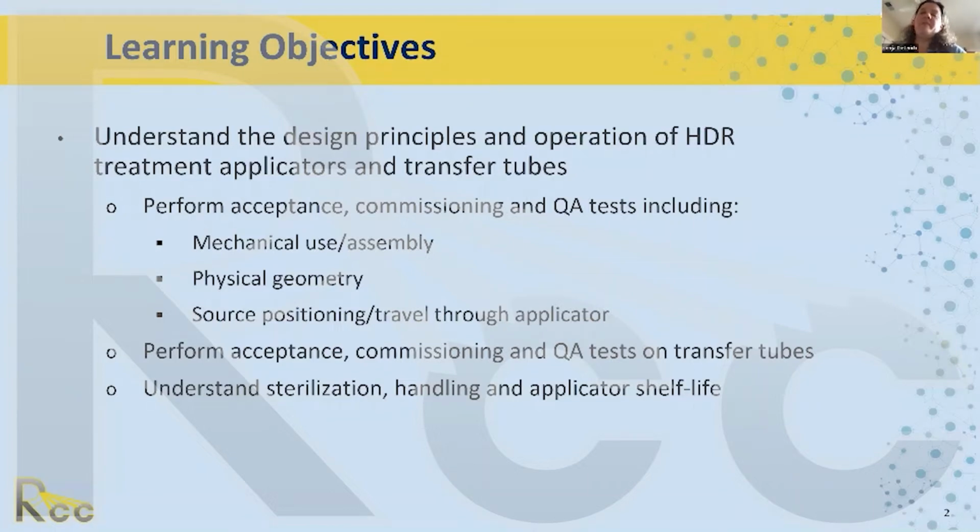very important. I had a transfer tube just fail on Friday in my HDR treatment, so it's very important to keep them checked. And then understanding sterilization, handling, and applicator shelf life.